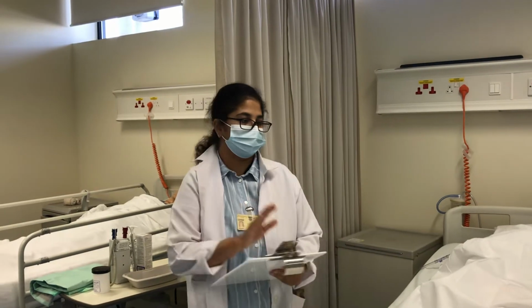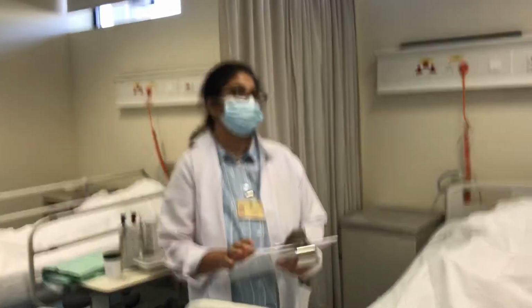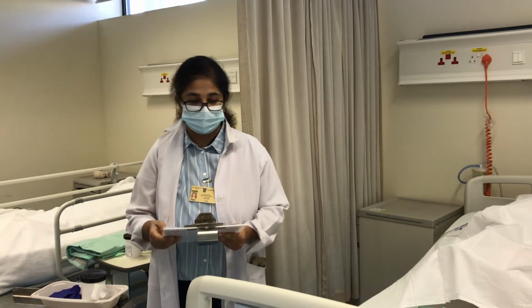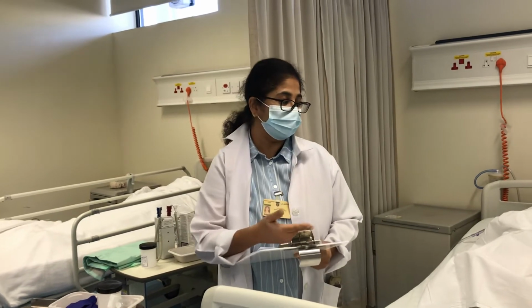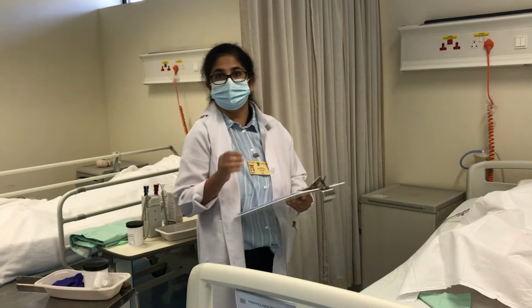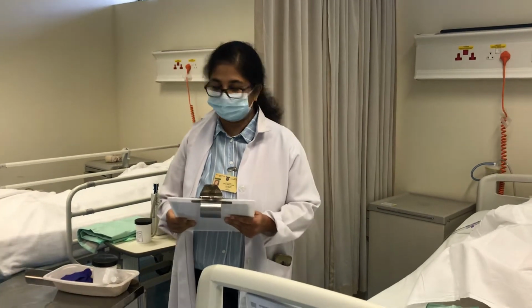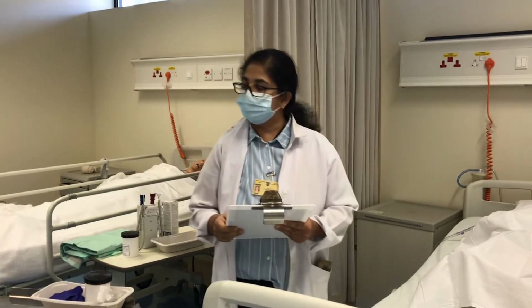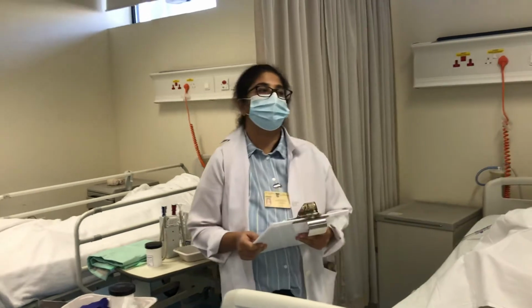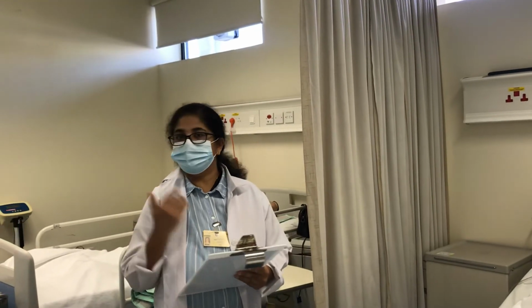There is an order for Mrs. Rukaya. This is a patient of 65 years old, a grandmother. She's having continuous dribbling of urine, and there is an order to insert the urinary catheter. That is one of the intentions of today's procedure. So what else? Before going to start the procedure, let's see the assessments.